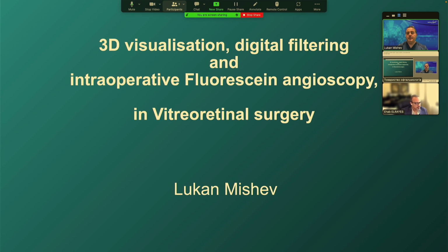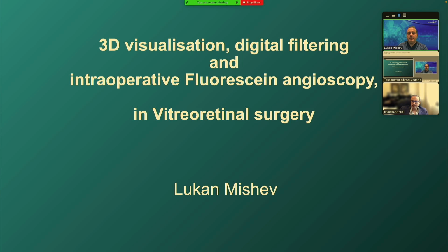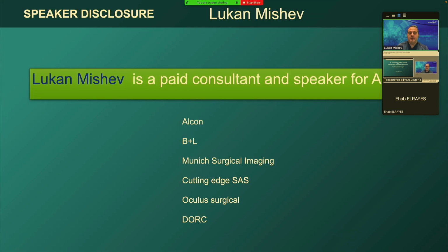Okay, thank you for the invitation to present here. I will talk about the 3D visualization, digital filtering, and intraoperative fluorescein angioscopy in vitreoretinal surgery. These are my disclosures, and some of them are particularly related to the topic.